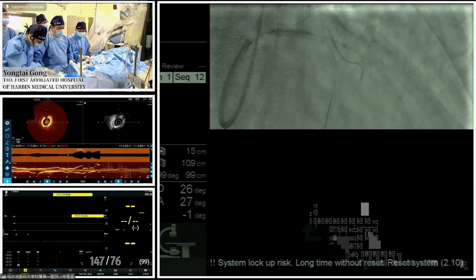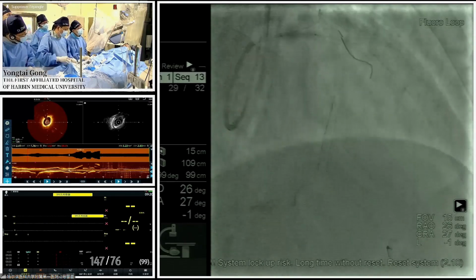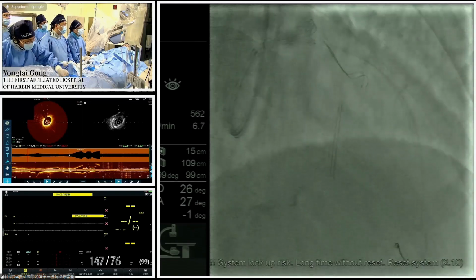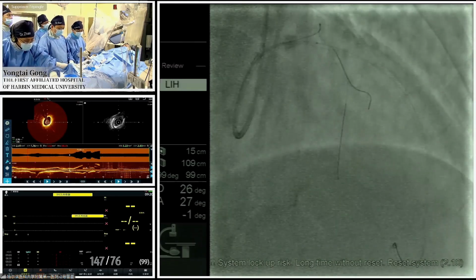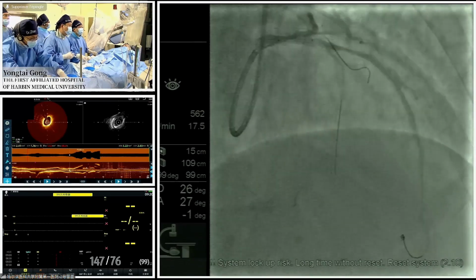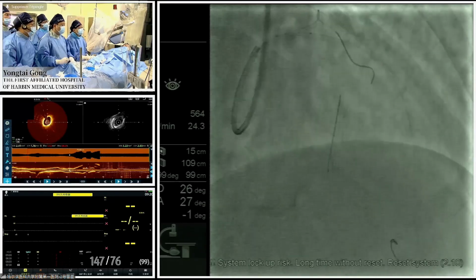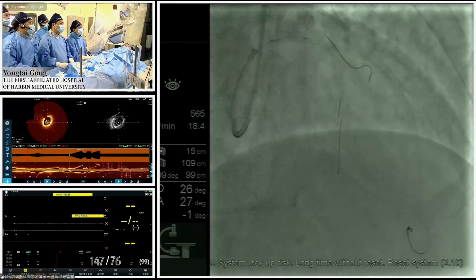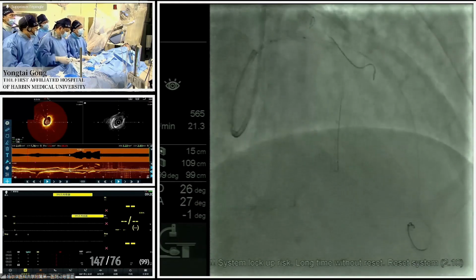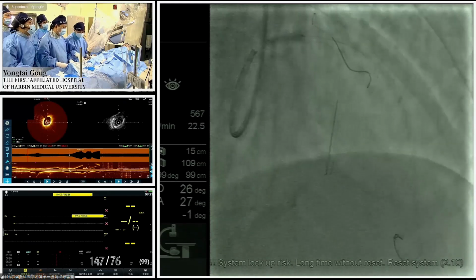The pressure waves are able to selectively break both superficial and deep calcium within the vessel wall, creating macro fractures in the calcified plaque. Vessel compliance is increased, and IVL thereby facilitates adequate balloon and stent expansion. Soft tissue vessel trauma is minimized as the sonic pressure wave passes through the non-calcified tissue as a result of minimal differences in density.